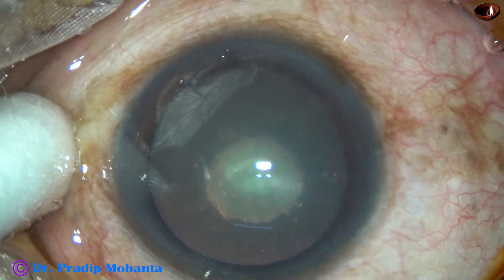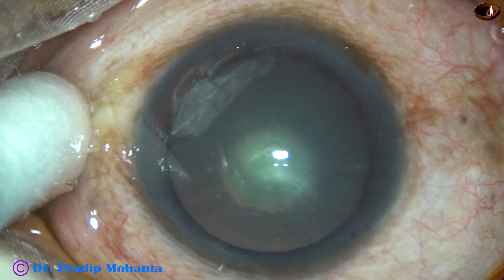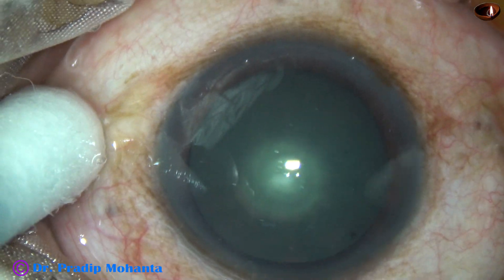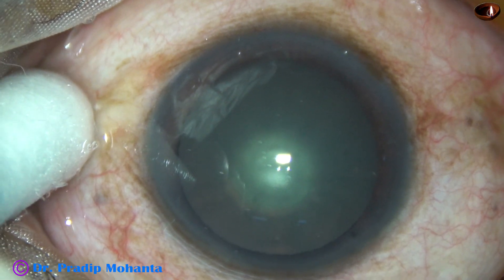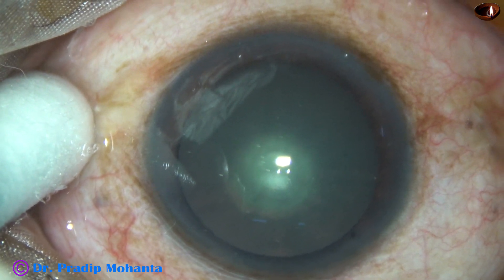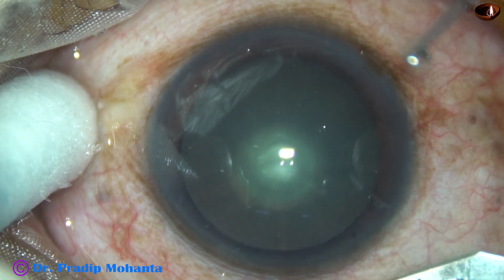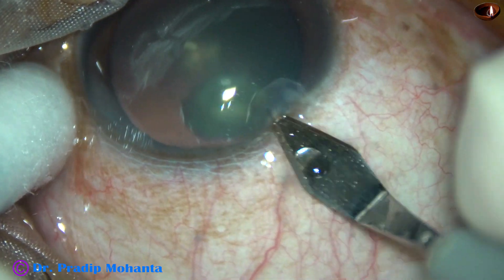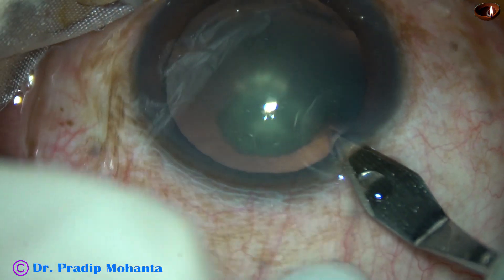As you see, this is a posterior polar cataract. Most of the lens is clear, except for that round onion hole-like appearance — an opaque area. So let us observe this surgery.